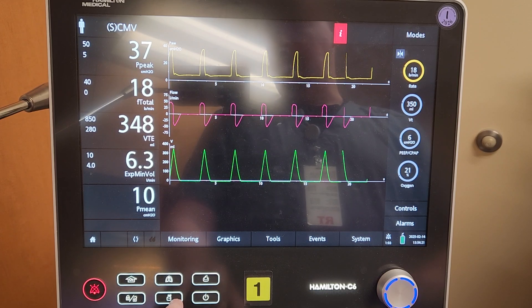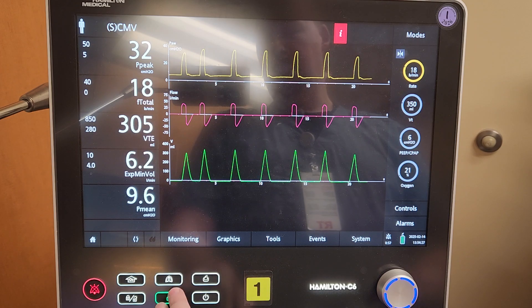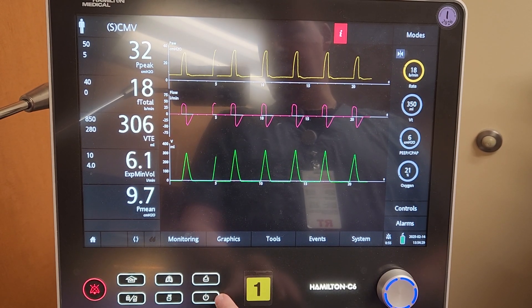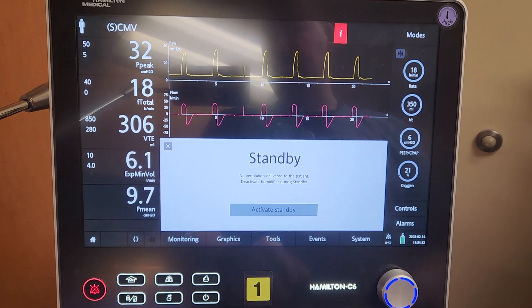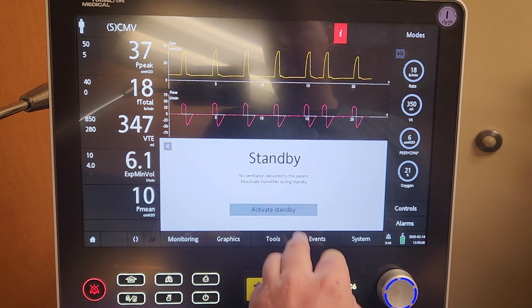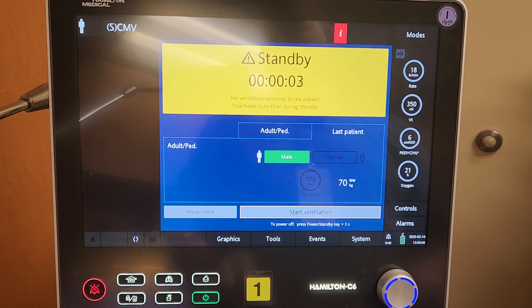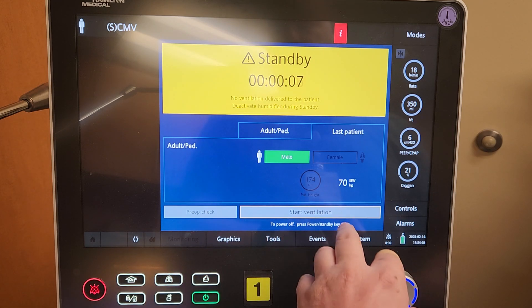We also have the nebulizer button, which will not function currently because there is nothing plugged into the front of the ventilator. And here is the power button — if you accidentally press it, it just asks if you want to go into standby. If you press and hold it all day long, it will not turn off the ventilator. To turn it off, you'd have to go into standby and then turn it off — there are extra safety steps involved.